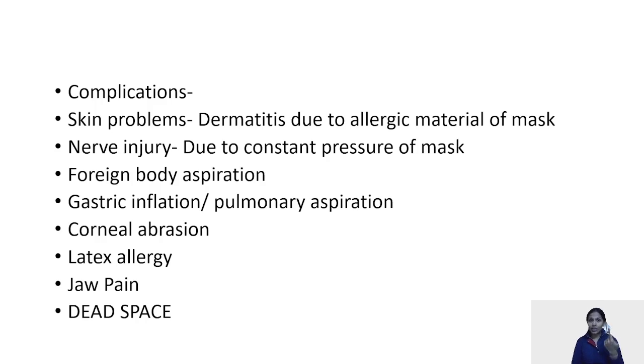Corneal abrasion has been seen because of the bad technique of using these masks. Then, latex. Many a time these masks are made up of rubber or latex, which the person can be allergic to. Jaw pain can be there, and the dead space increases.